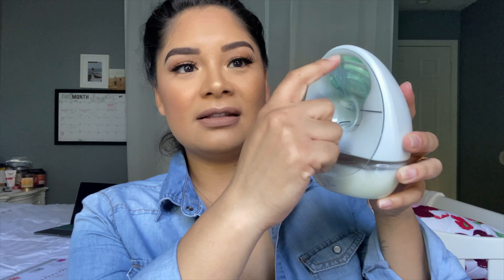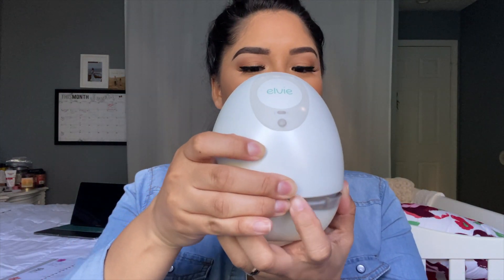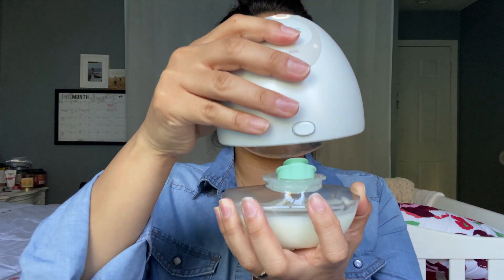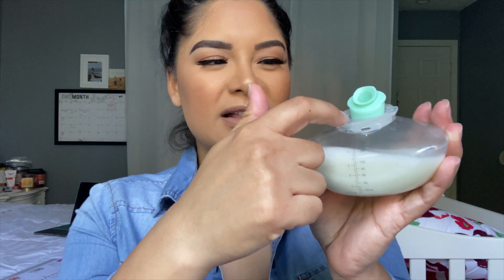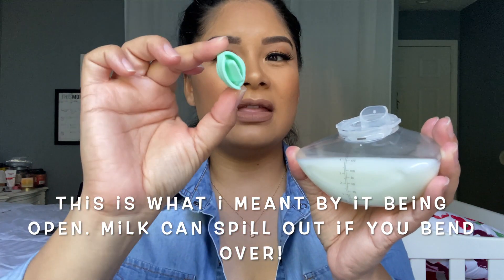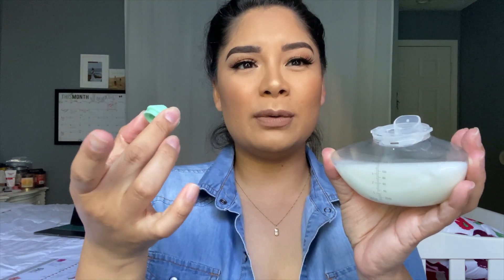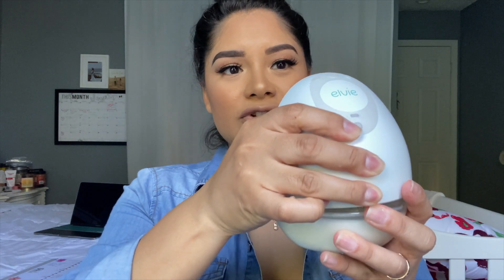Let me quickly show you what it looks like. Here's the back side — this is the flange, the seal, and you use this button to separate the bottle from the hub. You can see the little cover with a pour spout, and this part acts like the membrane in a traditional pump, making it easy and convenient to pour the milk into bottles or breast milk freezer bags.